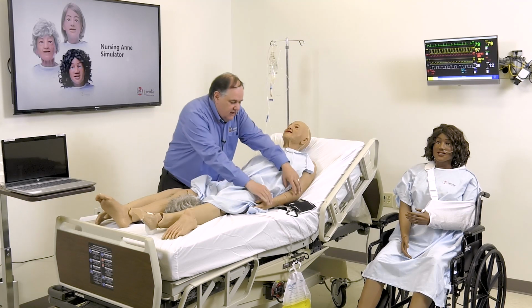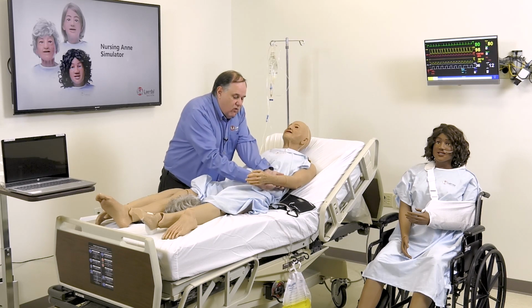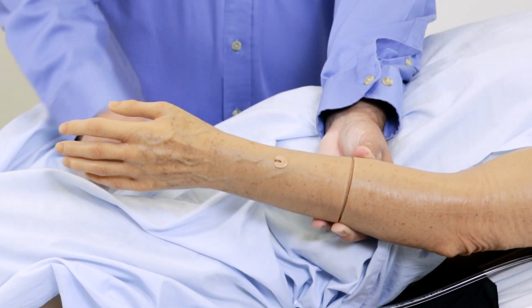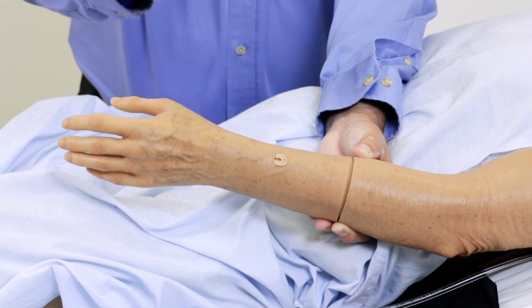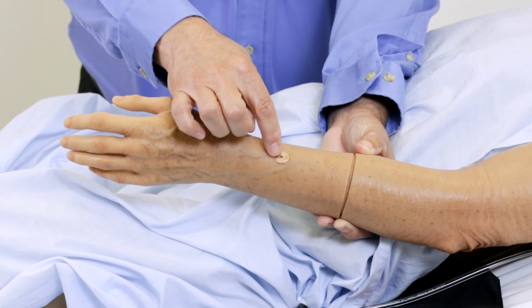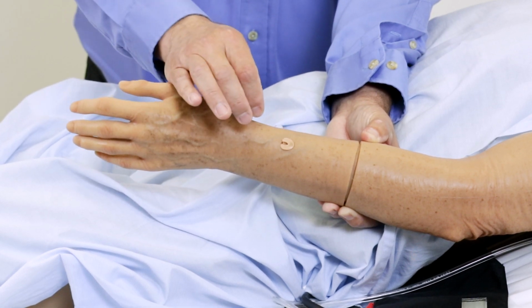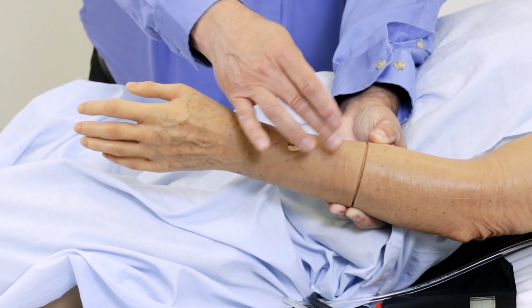This arm's free. So we actually have this new style of an IV port. It allows you to actually pass through the catheter. So again, I'm sorry, I don't have a real catheter with me right now, but you would take your real IV catheter and you would cannulate through this little hole here. And the purpose of this, it allows us to actually do the psychomotor skill of the cannulation and actually remove the needle and then infuse fluid without it leaking, right?